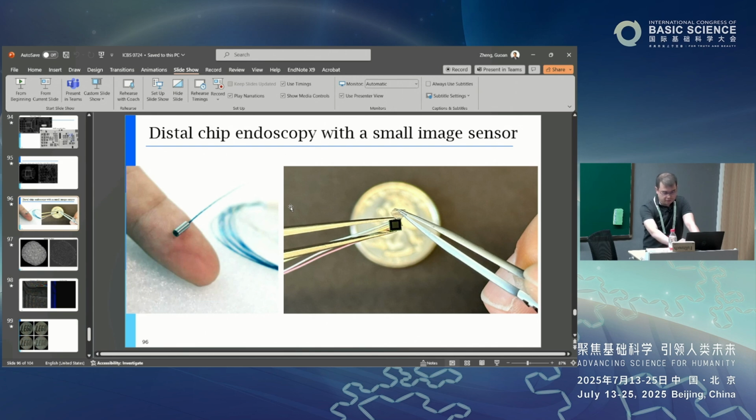You're absolutely right. Yes. Right now, the image sensor is square, but the shape here is circular. So they do have some gap for the illumination. The gap is where you can insert fibers to illuminate the object. But one design is to change this circular shape to a square shape to match the image sensor. Or just like what you say, you can have a flexible sensor to do this. Yeah, but absolutely yes.